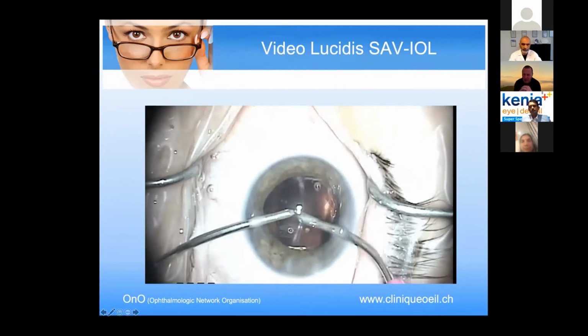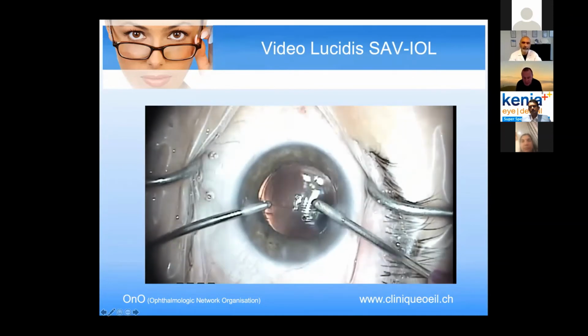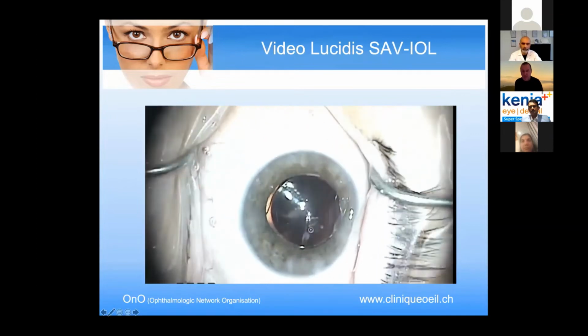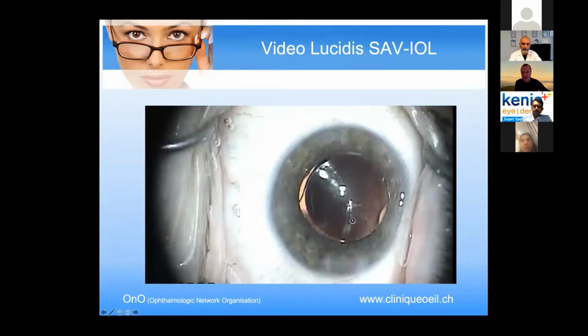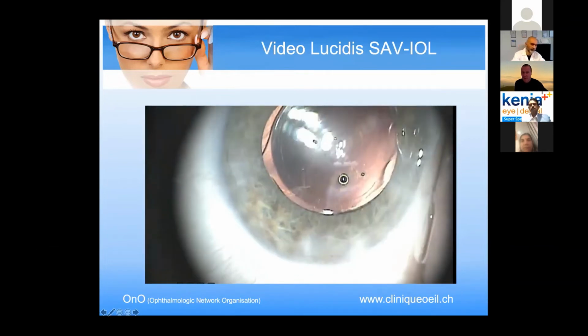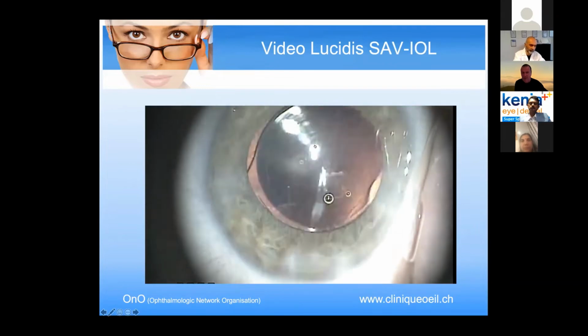It's quite a good lens. As you can see in the beginning here, you can see this little bubble and this reflection of the lens. It's very important that you center the lens. If you have a problem with the bag, you will have some problems. You see here, it's very important to center the lenses.